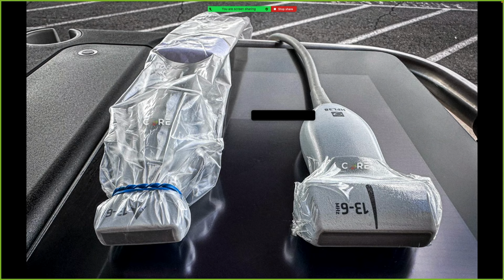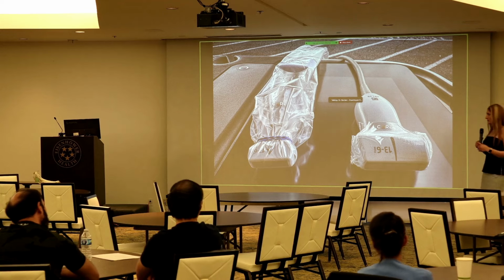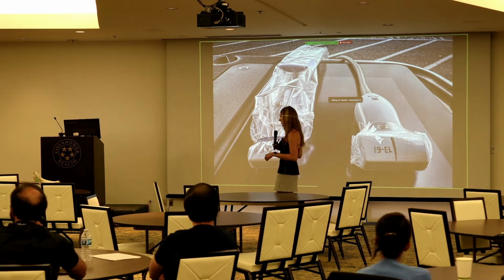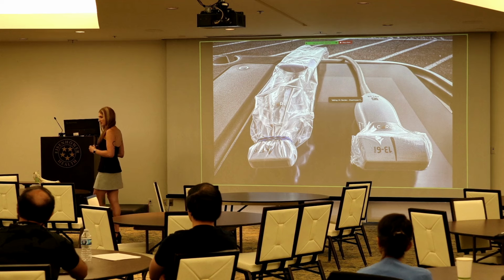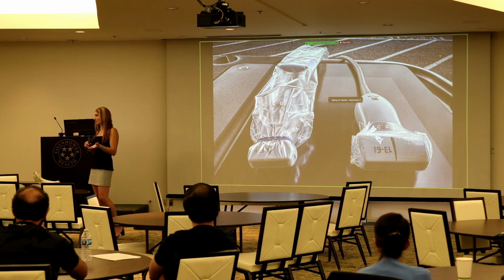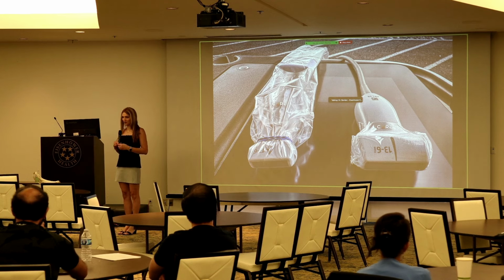Do you guys have gray tops or purple tops, the wipes? We have Sono, like a pack. Yeah? And the purple tops. Okay. Great. Or the gray top, is it kind of like the ultrasound one? The ultrasound ones are the Sono wipes, yeah. Ultrasound wipes. I wonder if they're different from the gray wipes. Because for us, the gray wipes are the ones that they recommend using for machines, but honestly the purple wipes would work fine.